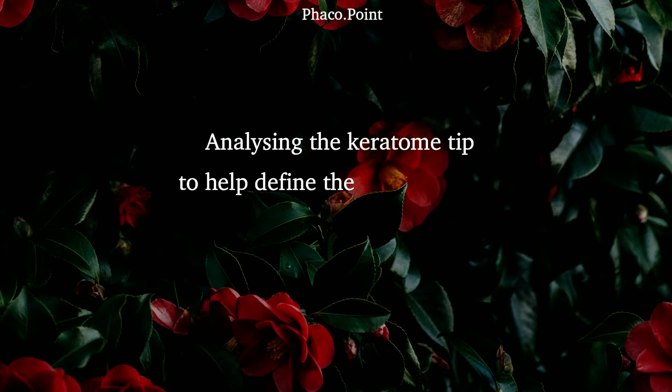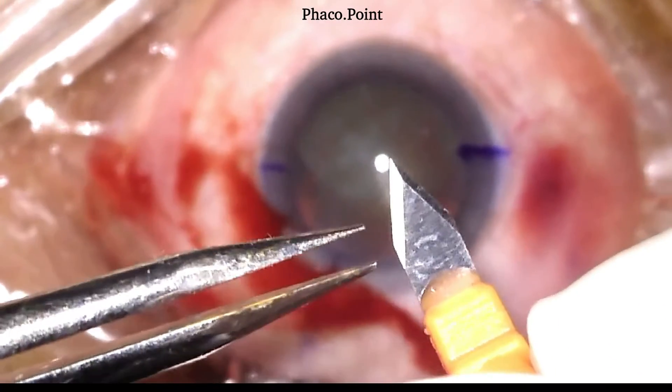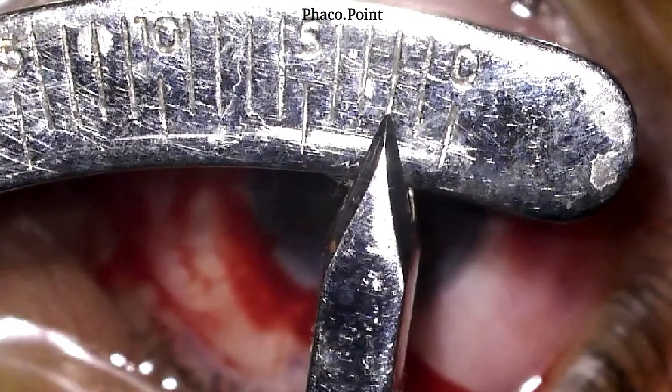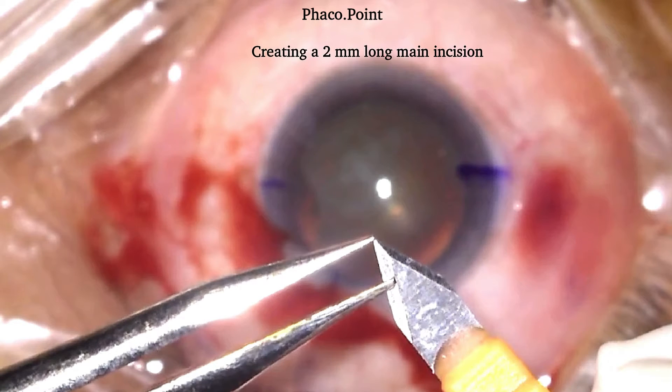Having understood that the width of our tunnel is always going to be fixed, we now try to understand how much into the cornea we need to go prior to piercing Descemet's membrane and entering the anterior chamber. This defines the length of the incision — that is, from the limbus inwards, how much do we go. If we fashion an incision which is 2.8mm wide but 1.7mm in length, this is the extent of entry of the keratome into the cornea before piercing Descemet's to enter the anterior chamber. Should you plan for a slightly longer tunnel — 2.8mm wide and 2mm long — this is the distance you would need to traverse the cornea before piercing Descemet's to achieve a 2mm long incision.